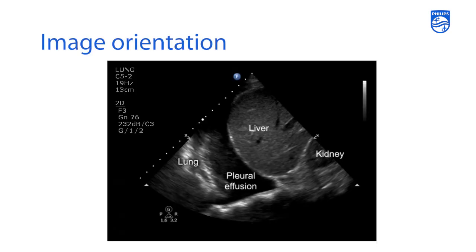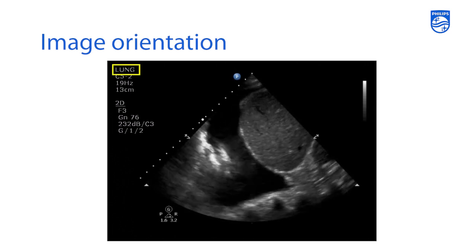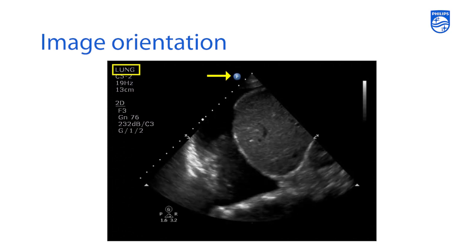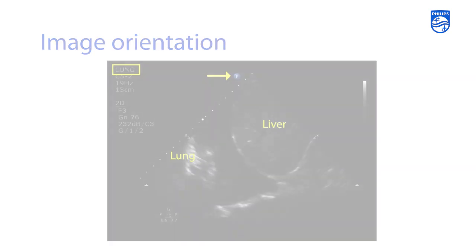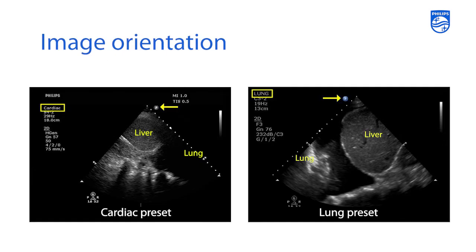When the image is acquired under a pulmonary preset, the orientation marker moves to the left-hand side of the screen, so the lung appears on the left and the liver on the right. The only reason for the difference is that the cardiac preset flips the image 180 degrees compared to abdominal or lung presets. The orientation of structures may differ depending on which preset the exam was performed under, so don't be confused by this when reviewing images in the series.